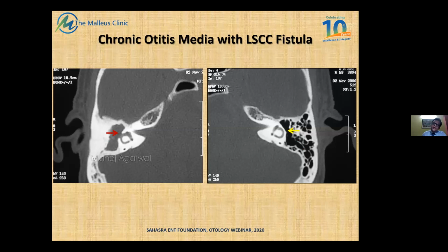if you see that the trabeculations of the periantral air cells are maintained, chances are it's not cholesteatoma. Chances are it's either effusion or even granulation. Granulation does not easily cause erosion of the trabeculations of the periantral air cells. Remember this. Whereas cholesteatoma is very notorious for causing erosion of the periantral air cells. Most of the time, the moment we enter the mastoid antrum, we see one big cavity totally occupied by the cholesteatoma matrix. So that is one tip I can give you for identifying whether the isointense shadow is a cholesteatoma, granulation tissue or effusion. Effusion definitely is not going to erode the trabeculations.